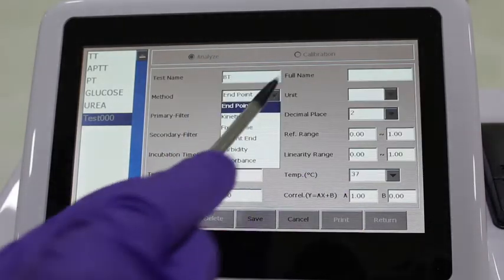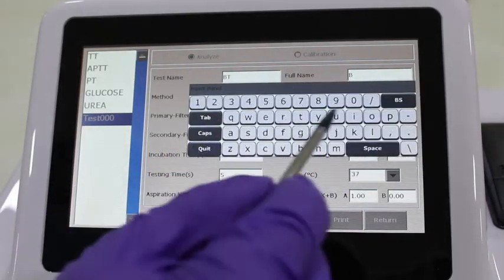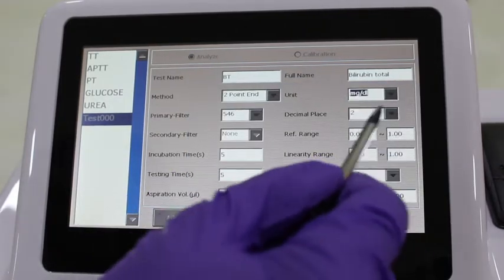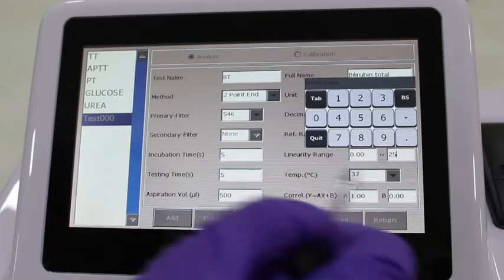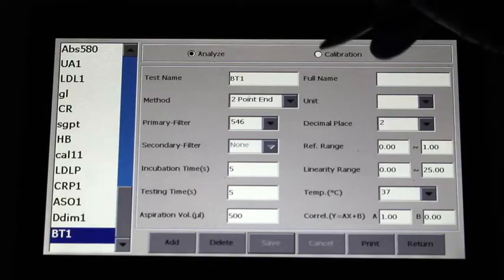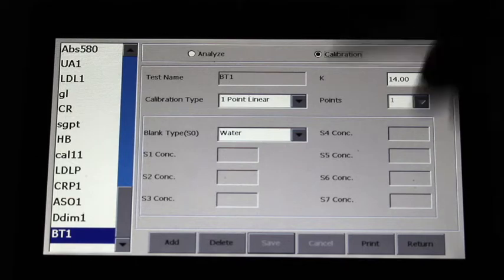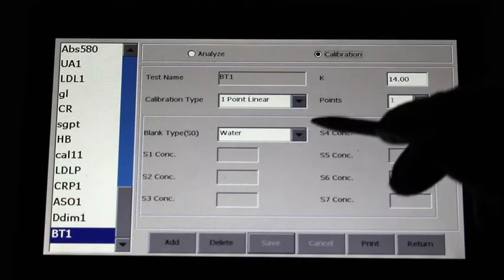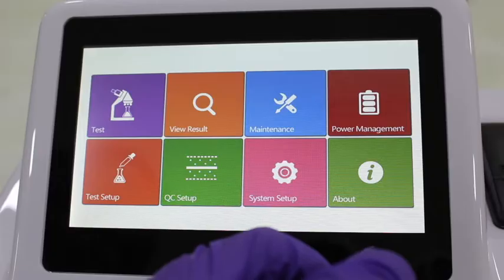Now in the test setting, go to analyze new page and program for bilirubin total. Add test name, unit, filters, incubation and read time, decimals, normal range, linearity, temperature, etc. Now go to calibration page and enter type of calibration as one point and add the factor value. Here blank is sample blank, but water blank is selected as sample blank option is not displayed.